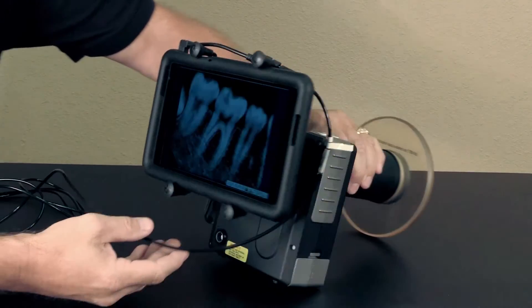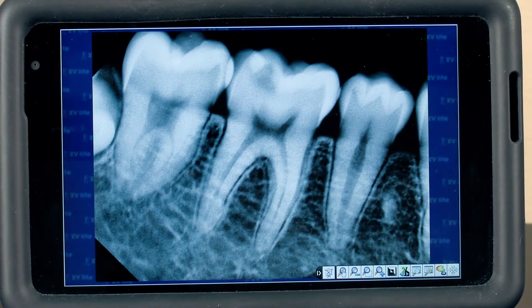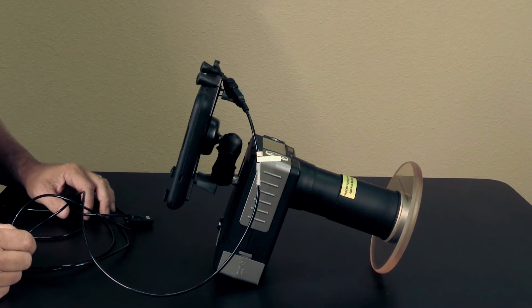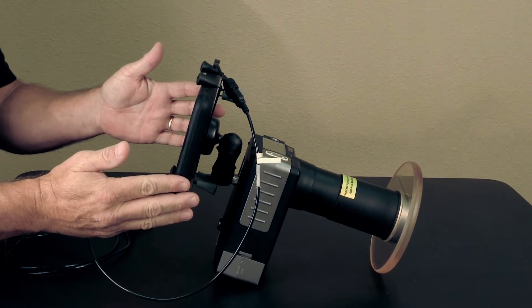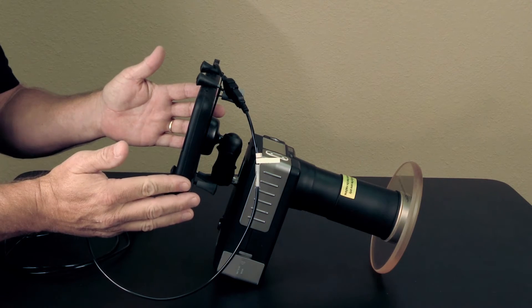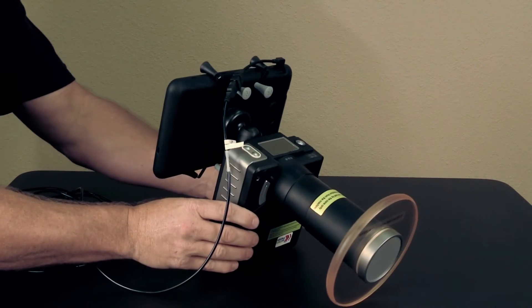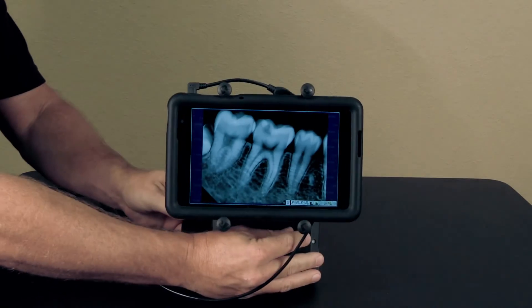This is the type of image quality you can expect with this unit. It is fantastic for implants, for checking endo depth, or for taking quality images anywhere in the world. There's nothing else on the market like it that's completely portable.